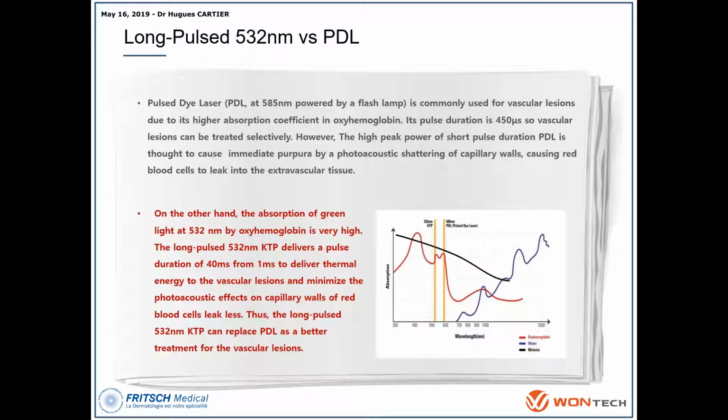So some patients and some practitioners prefer PDL. In my office, I have both, but with the 532, it's easy. Maybe it could be easier to manage, because in this laser you have a touch screen, you have an expert mode, you have an automatic expert setting as you want.